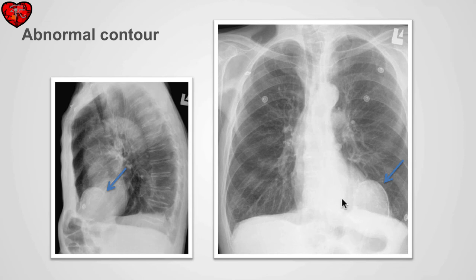In this case, we have an abnormal left contour of the heart with a focal bulge in the contour. We can also identify curvilinear calcification both on the PA and the lateral X-ray. The abnormality is caused by an aneurysm of the left ventricle.